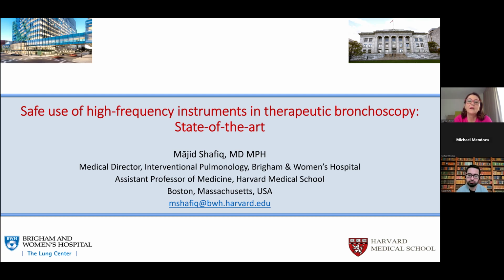Another question from, and I apologize, Dr. Simon. Not to mention the very real risk of major bleeding with cryobiopsy, in which case you would be scrambling to achieve hemostasis, right? With an LMA, it's really hard to get a balloon blocker in place, really hard to secure your airway. You would almost certainly need to exchange it out. Yes, in my opinion also, it's better to use rigid bronchoscopy when you perform cryo.